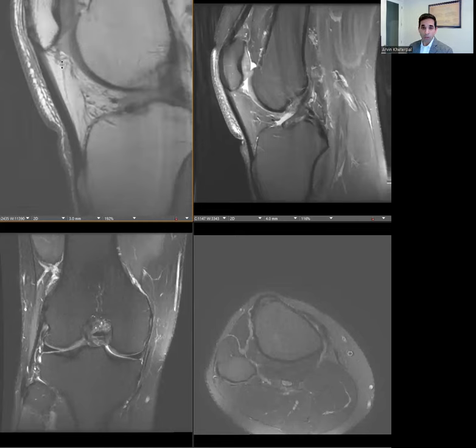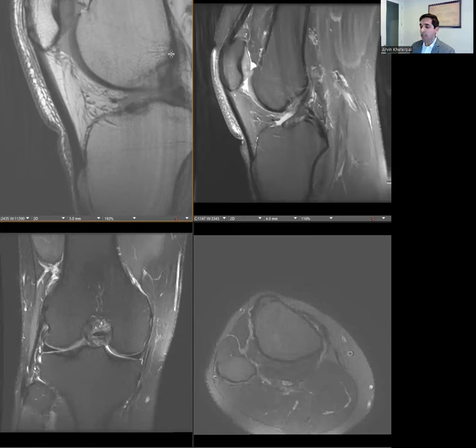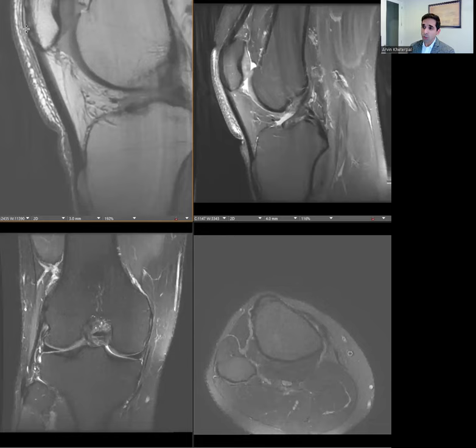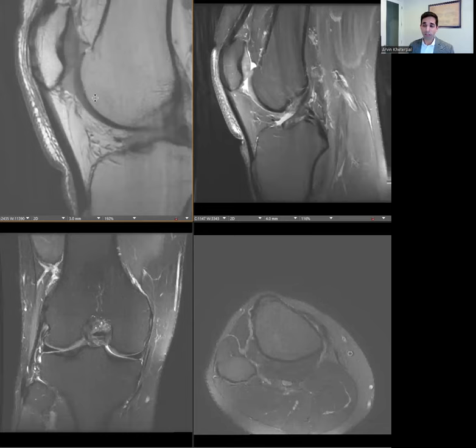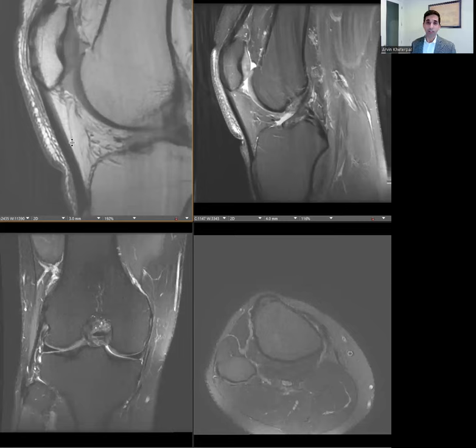The patellar tendon can also have a kind of layered appearance, similar to the quadriceps, but not as much so — it's not talked about as much, but it's something to keep in mind. One of the pitfalls to keep in mind is that when the knee is in full extension, the patellar tendon can sometimes appear redundant and you can get artifactual signal abnormality within the tendon. Again, this is a case where you don't want to over-call it as tendinopathy.